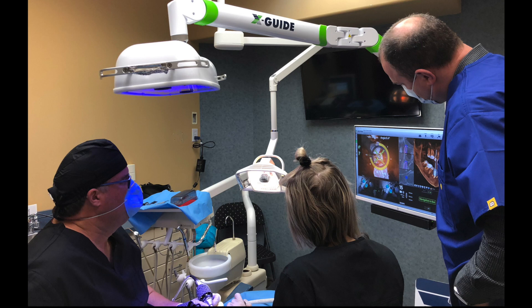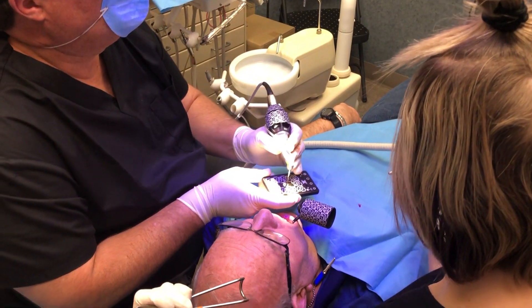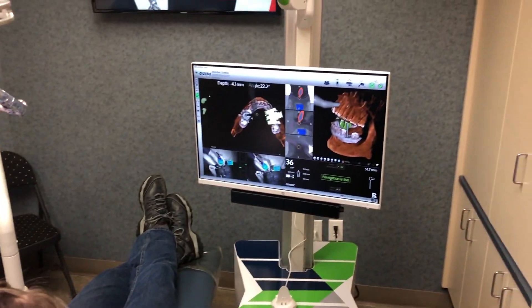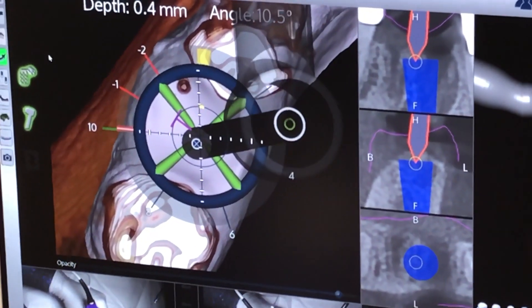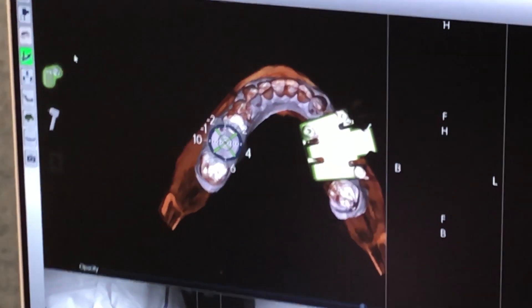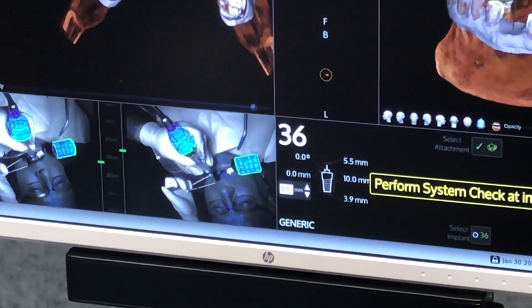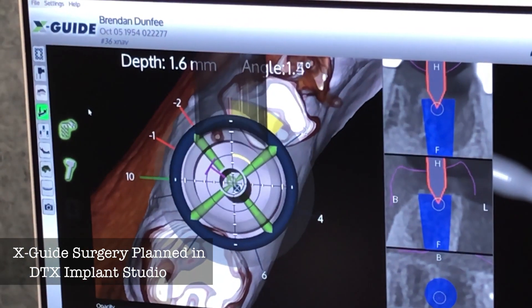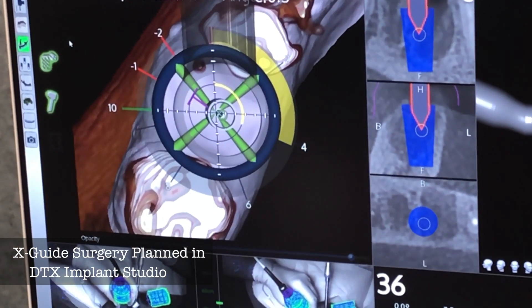You can see me looking at the screen — I'm actually doing surgery on my patient to get position, depth, and angulation. The implant osteotomy is being prepared by me looking at the computer screen, which is guiding exactly where the drill is going to go. I can avoid dental nerves and sinuses, making this very safe and very predictable. Here I'm calibrating the drills for length and we're going to use the X-Nav system to place the implant. This will keep my angulation and depth under control — it takes a little bit of practice, but I keep getting better every day. I've enjoyed the whole system and the ability to plan this implant in DTX software is really quite fantastic because I have such sophisticated tools at my fingertips.